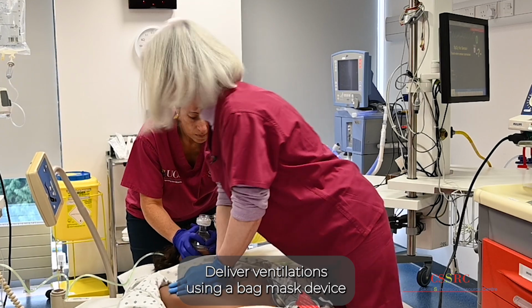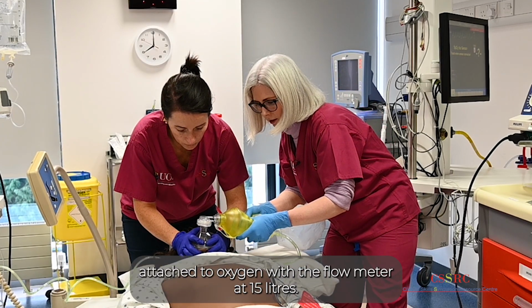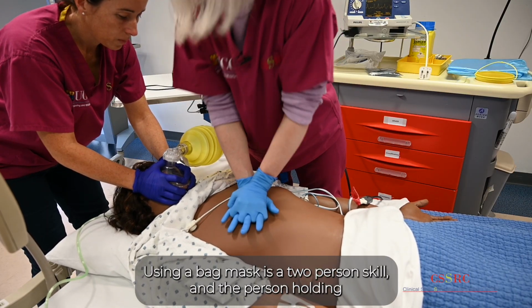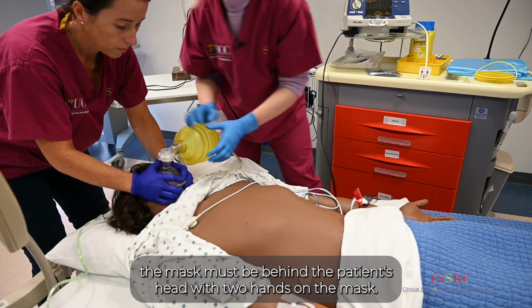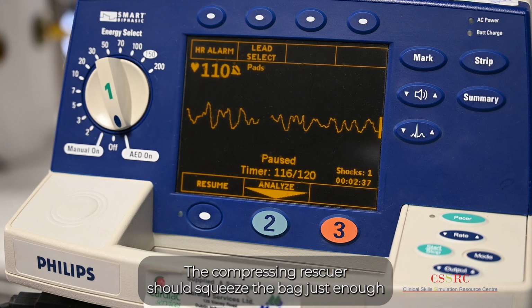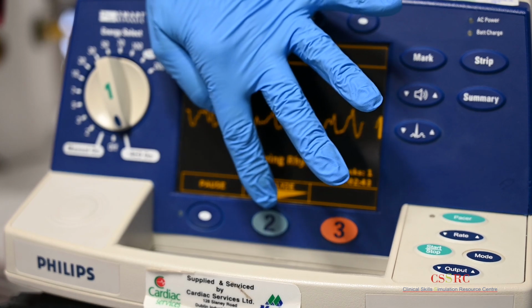Deliver ventilations using a bag mask device attached to oxygen with the flow meter at 15 litres. Using a bag mask is a 2-person skill, and the person holding the mask must be behind the patient's head with 2 hands on the mask, maintaining a seal and keeping the airway open. The compressing rescuer should squeeze the bag just enough to achieve chest rise, delivering each ventilation over 1 second.